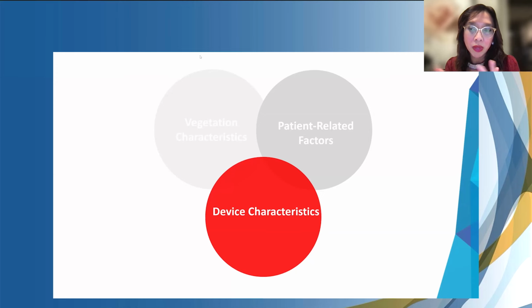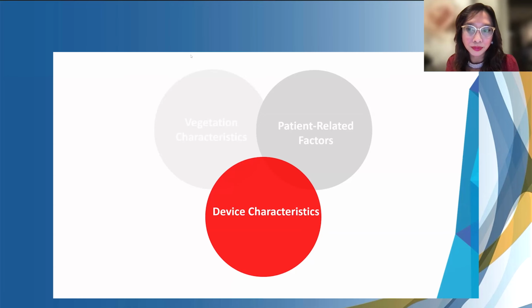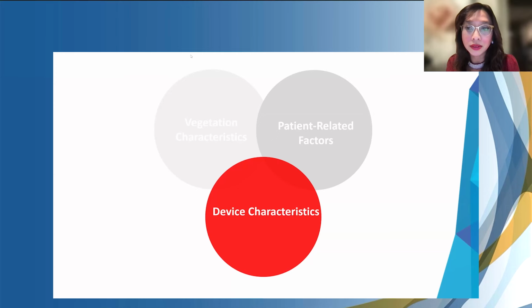So I think depending on the patient profile, patient selection, but I still think TE would be really helpful, and general anesthesia for these cases. And I think ICE might be a little challenging for far field imaging, especially if you've got things really subvalvular. Yeah. But given the size of these vegetations, I actually think with 4D ICE you'll be able to see them pretty well. Absolutely. In a lot of cases.